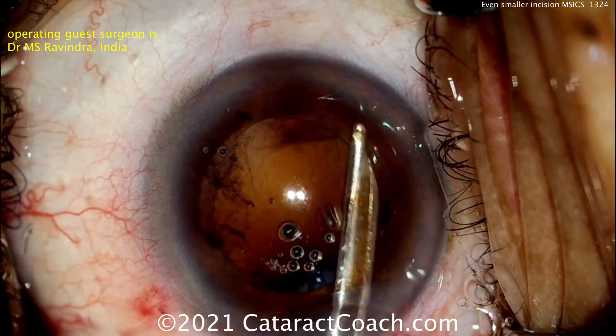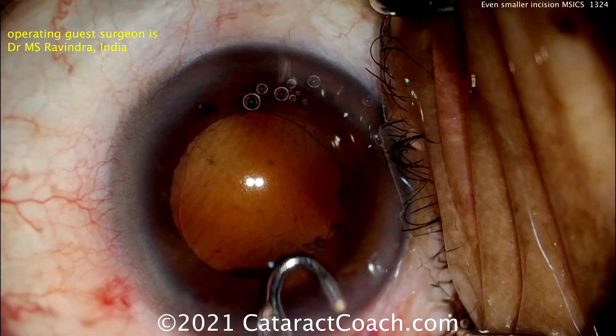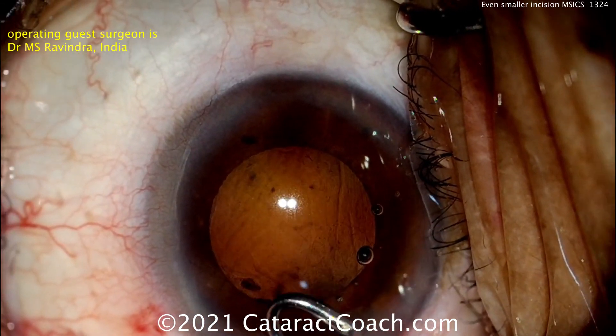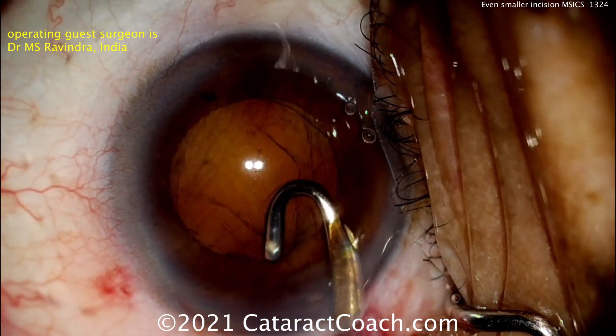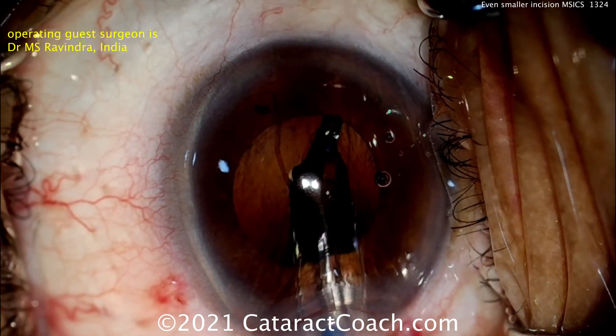Now the nice part of this surgery: it's low cost. No phaco machine used in this case. No irrigation-aspiration. Just manual instruments like a Simcoe cannula, or a curved J-cannula, cleaning up that sub-incisional space. More HPMC going inside — and that HPMC is helpful because look how big the incision is compared to that Simcoe cannula.